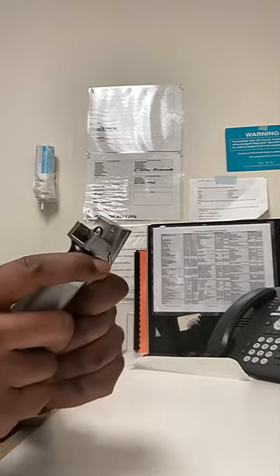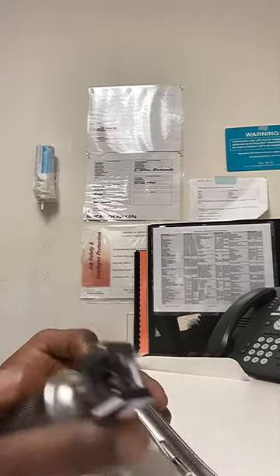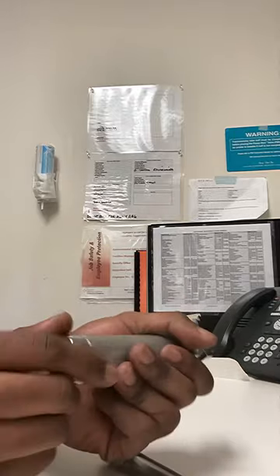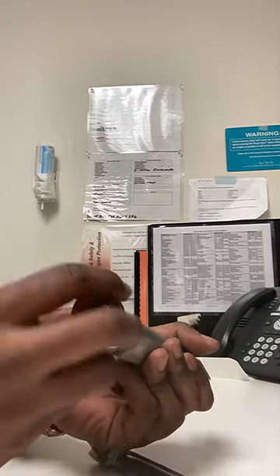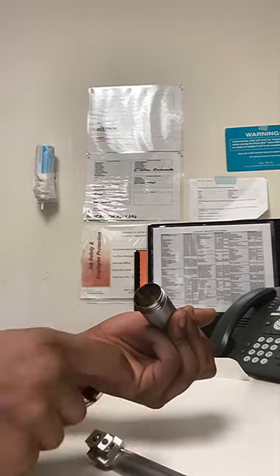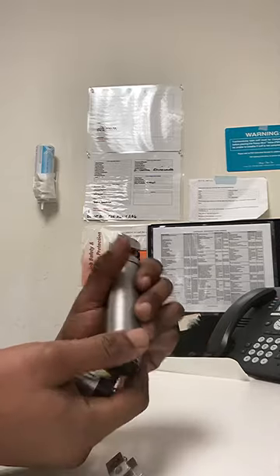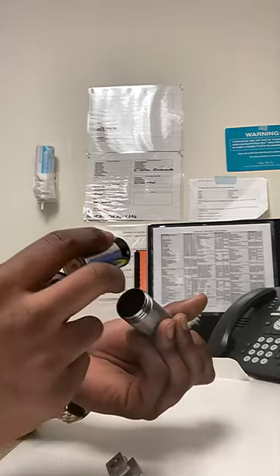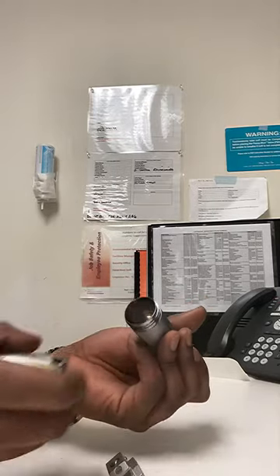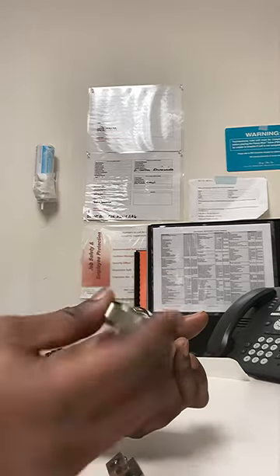This is a detachable head, so it's a Miller blade. This is the handle — it takes two C batteries. Sometimes when the light isn't coming on at the end of the scope, you might have to change the batteries.